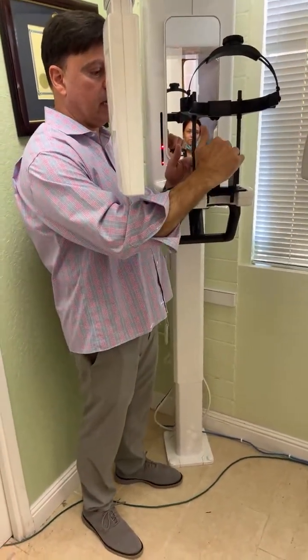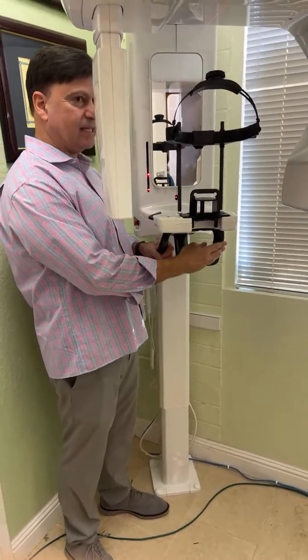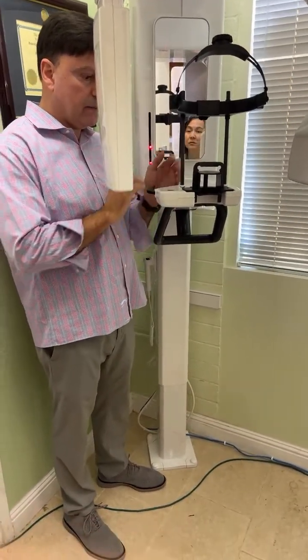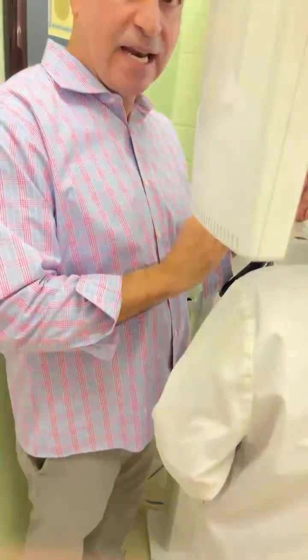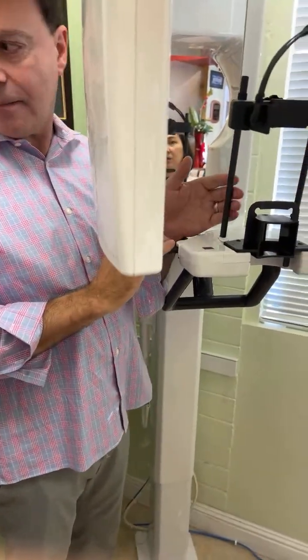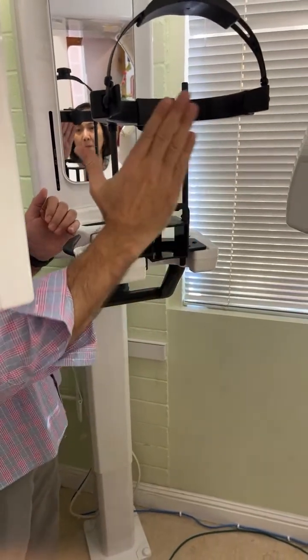The patient would come in. I told you about moving under. Hands are here, shoulders relaxed and down, lead apron. This is your head support. This has a locking mechanism here. Don't just release it or it'll smack the patient in the head. Okay, hold it. Okay, step back. Watch. If I just let go, you don't want that. Have this all the way forward when they get in so that they have nothing obstructing them.